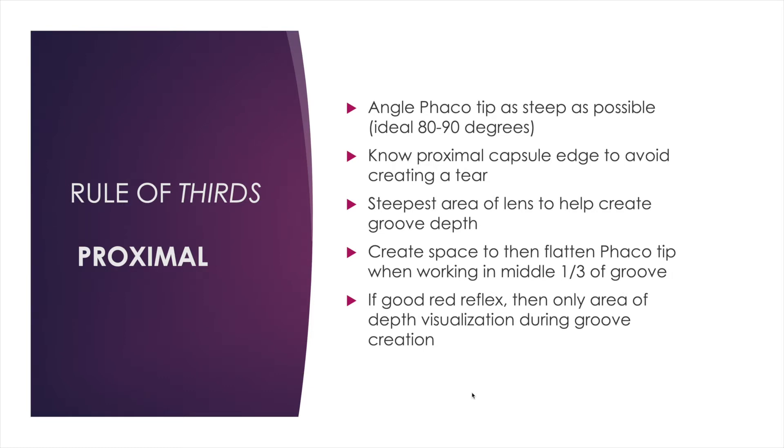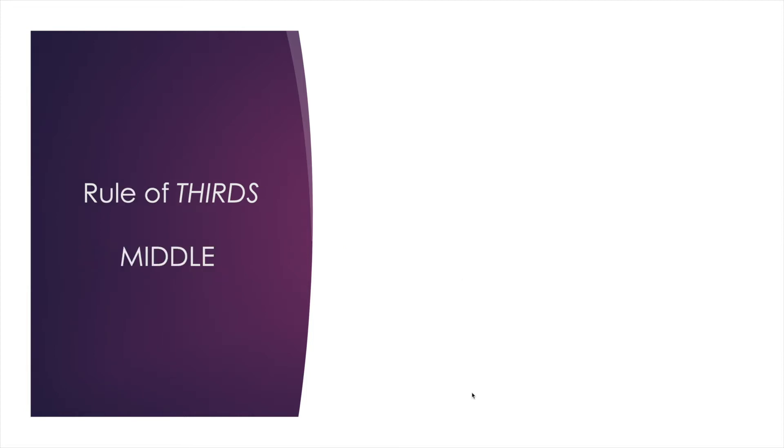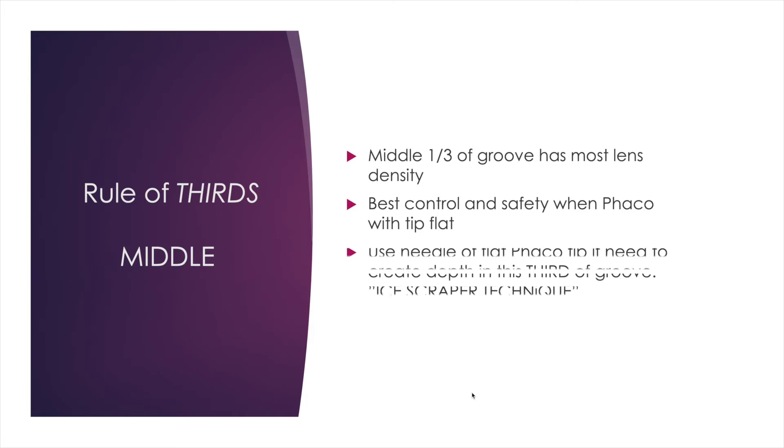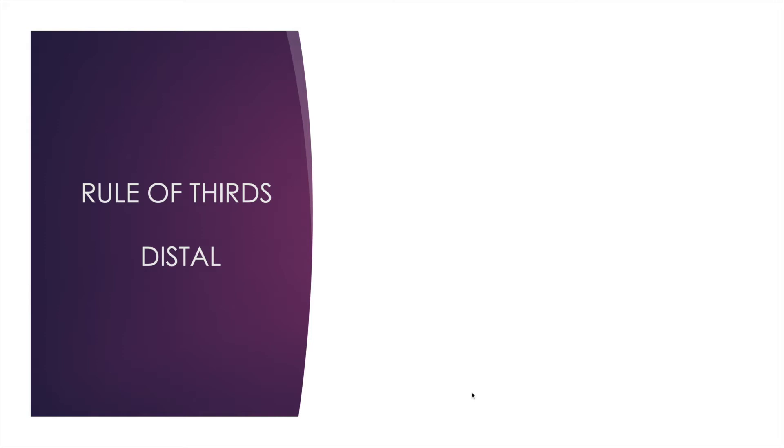This area also has a good red reflex, so you have good depth visualization while sculpting the proximal area. Once you get to the middle third—again the deepest area of the cataract—I start to flatten my tip out if I did a good job sculpting proximally. In a very dense lens, there's a technique using the flat tip in an ice-scraper-like technique that I'll review later.